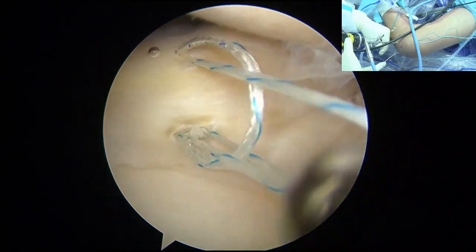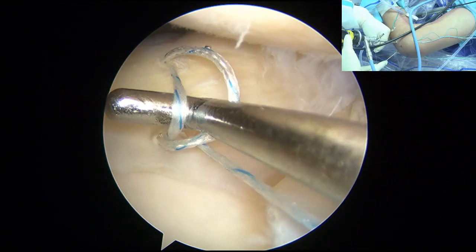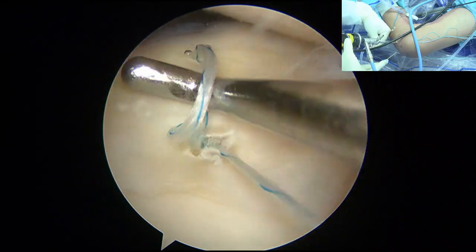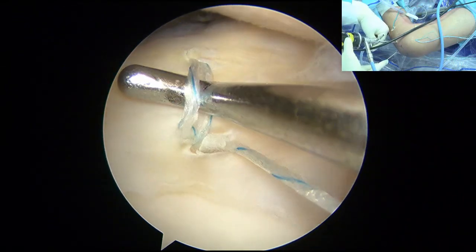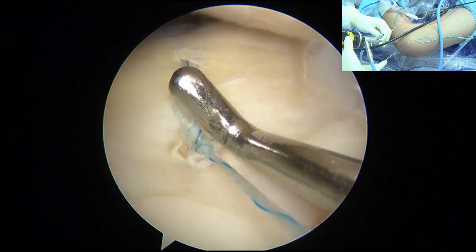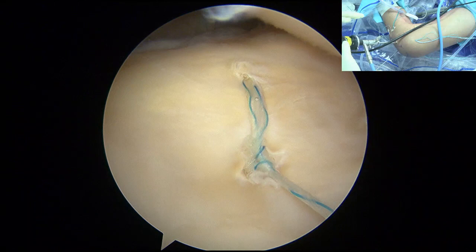那如果它不是单纯的半月板损伤，而是联合内外两侧半月板后方的撕裂，再加上PCL撕裂要重建的情况呢？那用fast fix就要特别注意。Especially if you didn't use this technique, you can easily pull it out. Okay. So using this technique is quite safe. 贯通那个关节囊。You slowly, 就这样子慢慢调整每条线的张力。This is safer. Yeah. Safer. Okay.